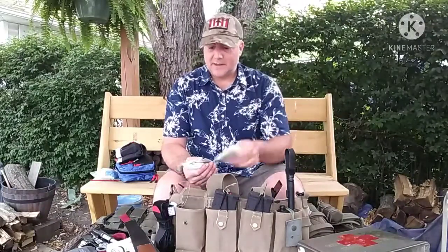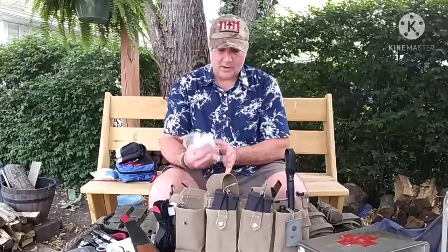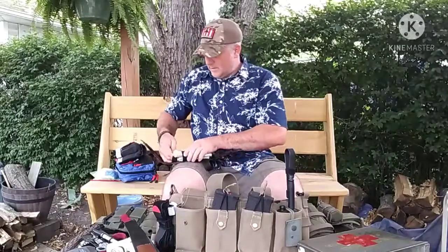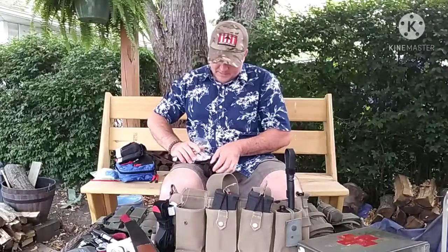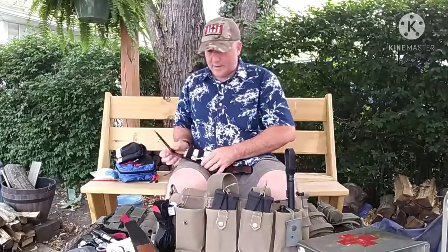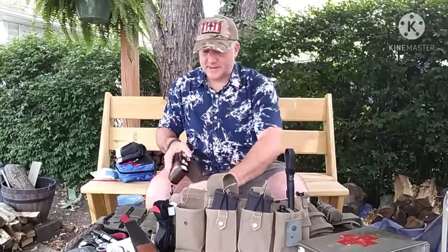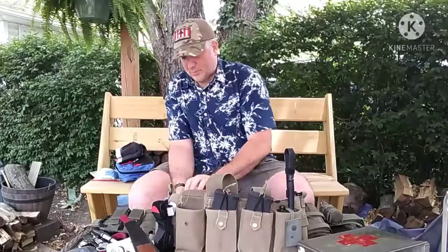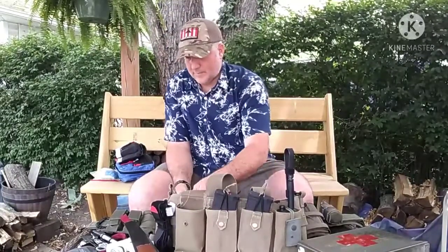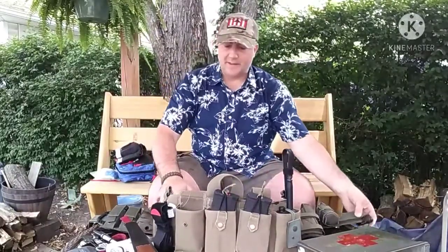So once again, chest seals. I have a compression bandage, clotting sponge, nasal airway. All of that just goes right inside and fits in a double AR mag pouch or a chest pouch on a chest rig, and you're no worse for wear there. Bam, bam, bam. Once again, there you go. Everything's in its kit. Everything disappears into its appropriate pouch. And then I also keep, you can see here, a set of trauma shears on the back side of that. Holds in place just through pressure and the Velcro on the back side.